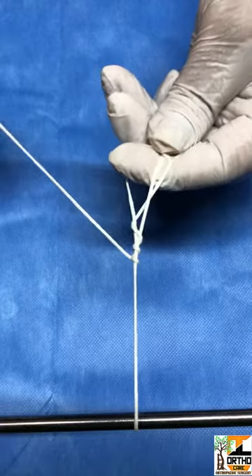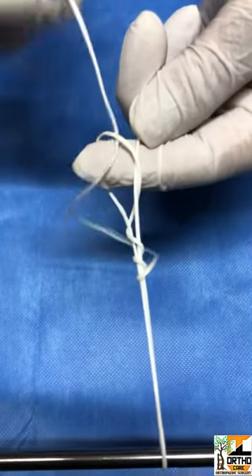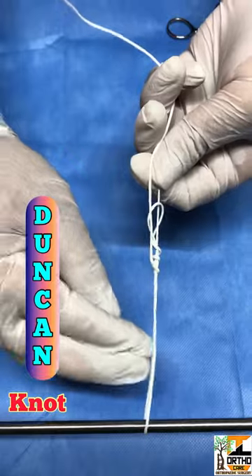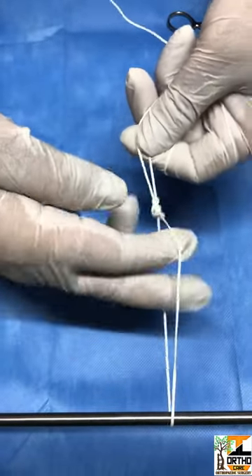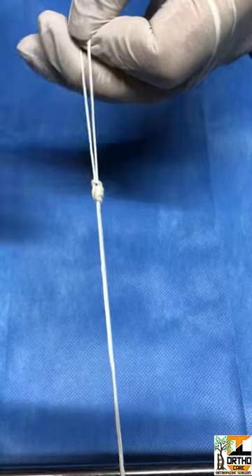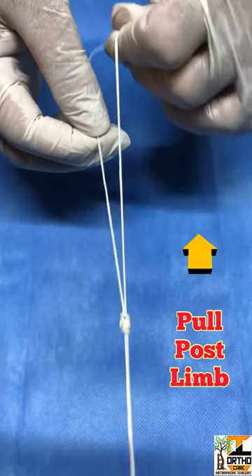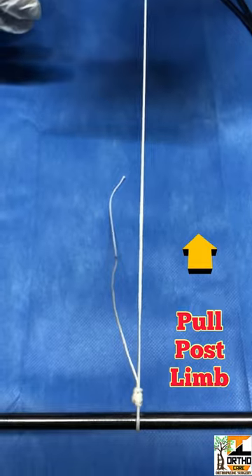Take the end and insert it into the pinched loop. Just hold it and rearrange the knot, then reverse tension it. You can see a nicely formed knot. Now just pull the post limb till it adheres.